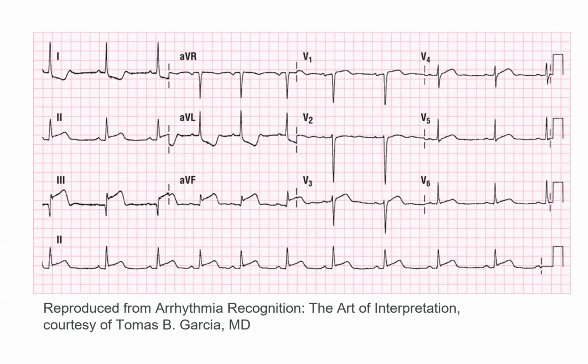I'm actually not 100% sure. It's close. I'm not sure if that's an inverted T wave or we just have that much depression coming back to the T. I'm not 100% confident. When I look at 1, I think those are just T waves. So that's probably the same in aVL. Anyway, look at 2, 3 and aVF.